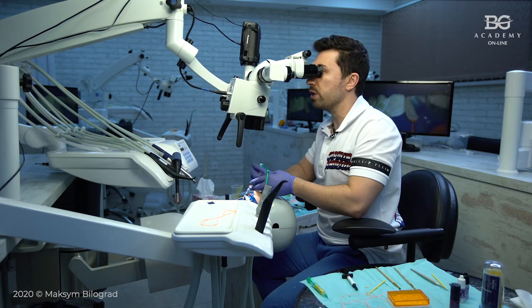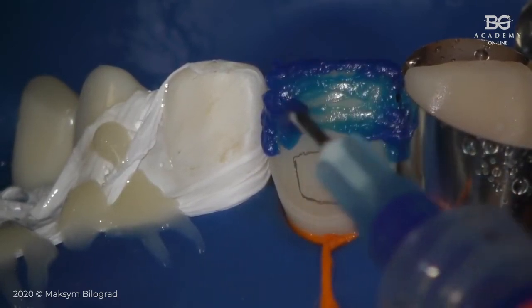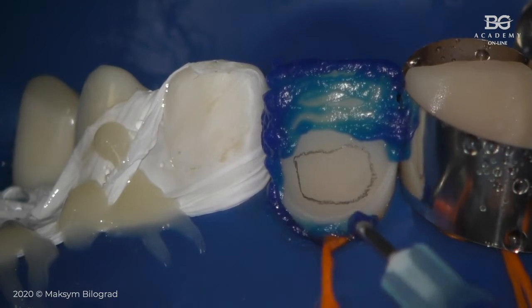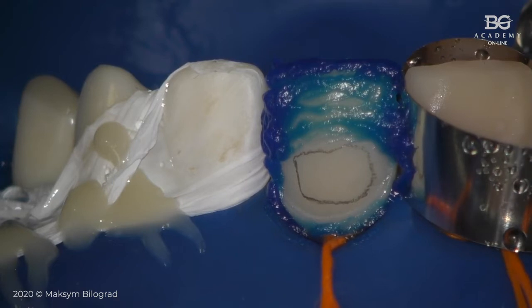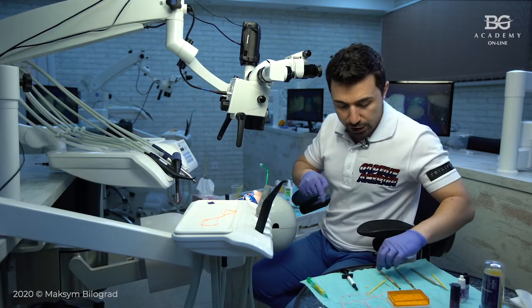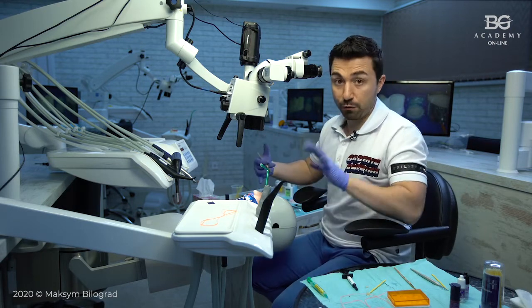I will put phosphoric acid on enamel only. Okay, leave it for 20 seconds. If I will use self-etch adhesive, I will leave my phosphoric acid on enamel for 30 seconds, okay? For 30 seconds, then I will rinse and then I will dry. If I'm using total etch system, I keep my phosphoric acid in the area of enamel for 20 seconds.